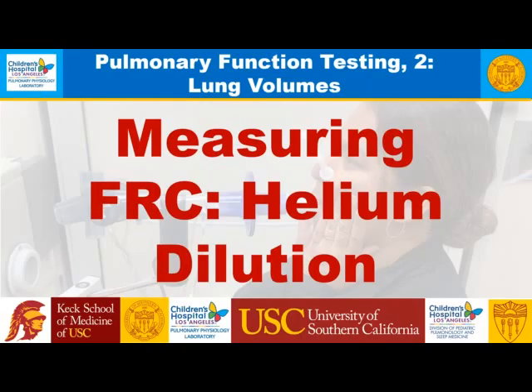Another technique is called helium dilution. This was the most popular way of measuring FRC prior to the computer era, because to measure nitrogen washout, you had to collect a huge amount of gas.